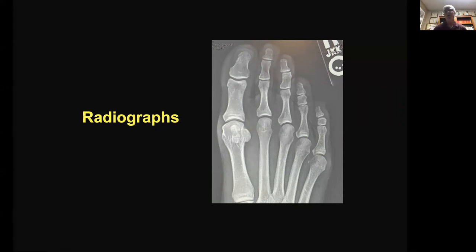So in this patient, I just want to make a comment that I never perform a forefoot ultrasound without reviewing updated x-rays first. Oftentimes the diagnosis is clearly revealed on radiographs rather than ultrasound. And at the minimum, radiographs are complementary. So we have a standing order in our department that if they don't have updated radiographs in the last 6 months to a year, they automatically get them.